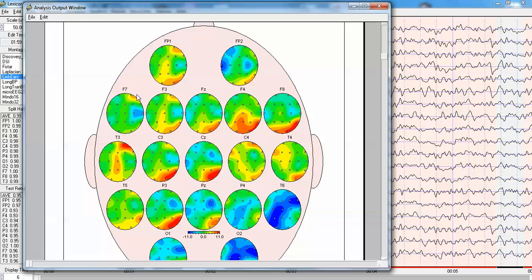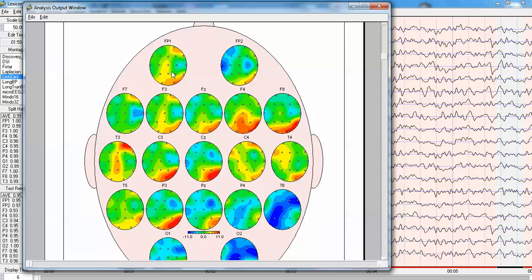As you can see here, this is the complementary colors, F7 to FP2, T3 to FP2. So the blue tells you one direction, that is the receiver, and the sender is the red.